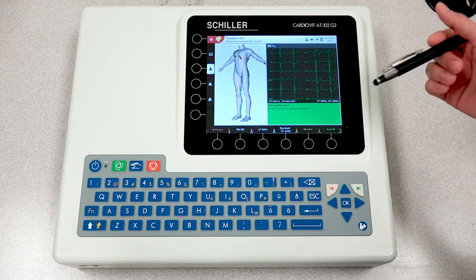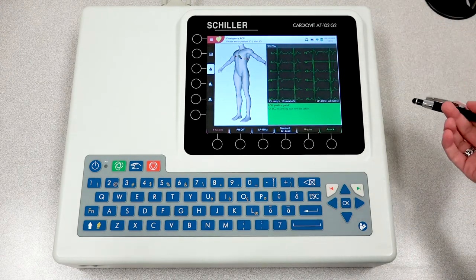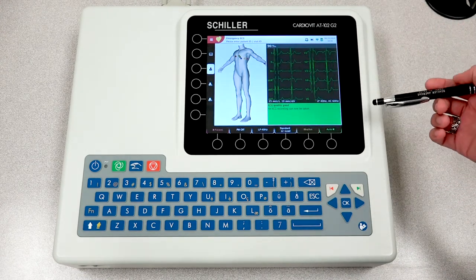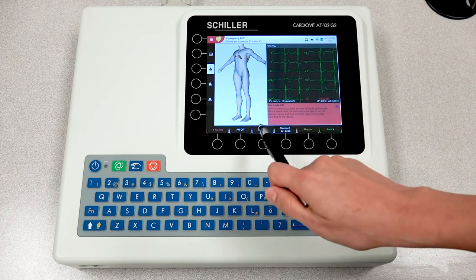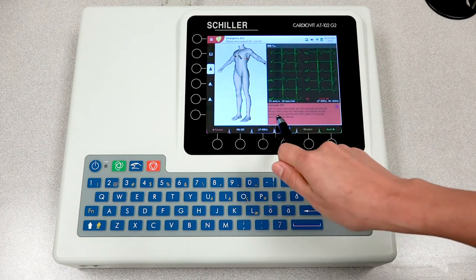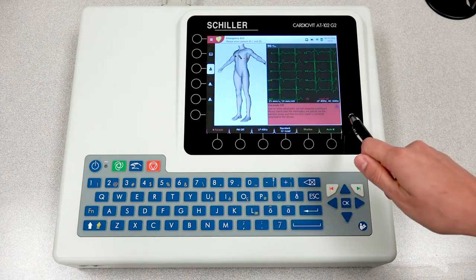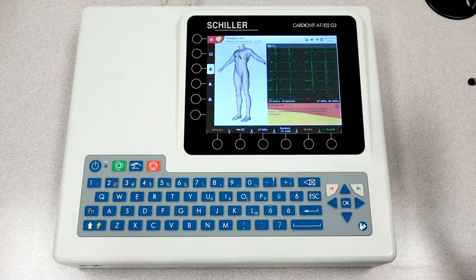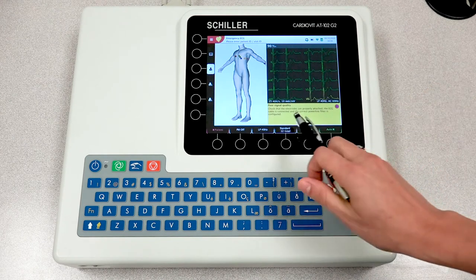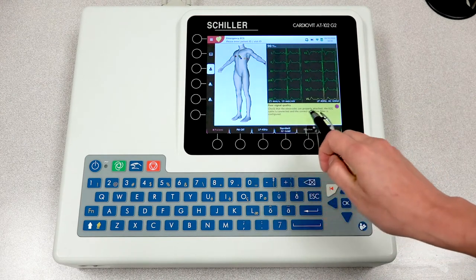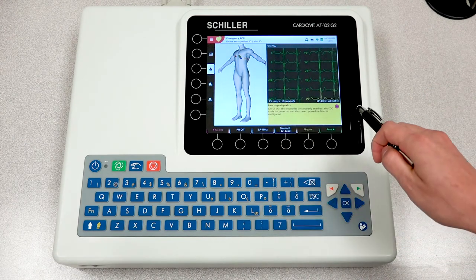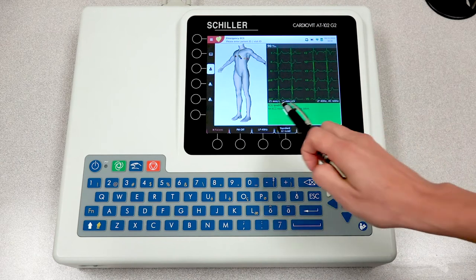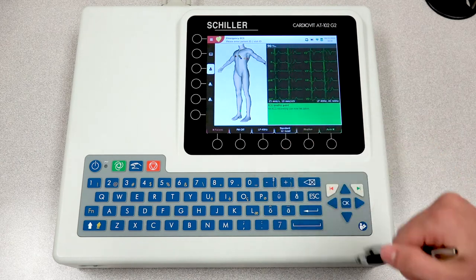If the ECG signal is indicating green, that means good ECG quality. If there is poor quality, no signal will indicate a red color, poor signal will indicate yellow, and a great signal will indicate green.